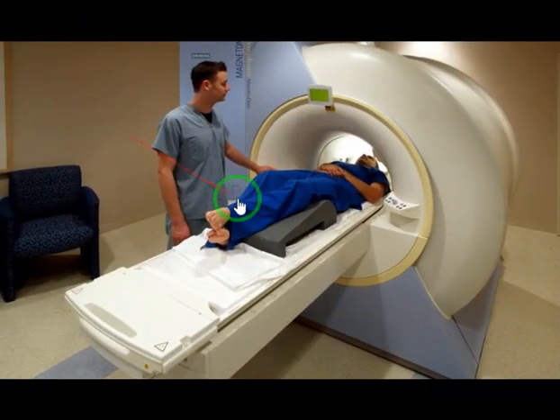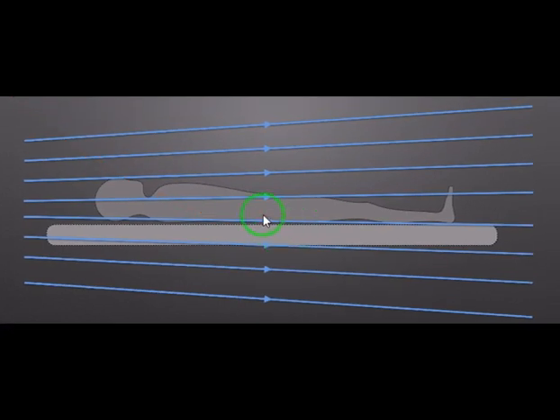You know that for the MRI the person is put into this big hole and we want to see what is happening inside here. As you know, our body contains a lot of water molecules, and the water molecules have the hydrogen atoms, and these atoms have the magnetic spin.